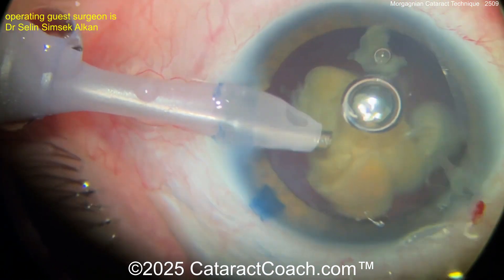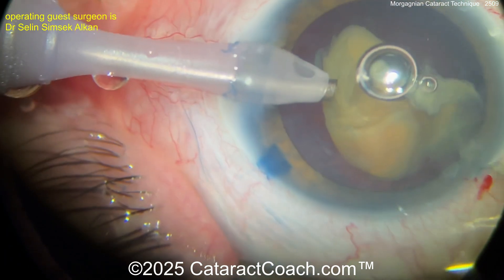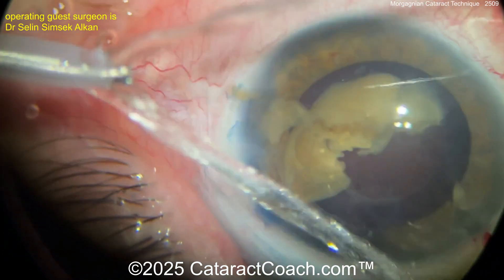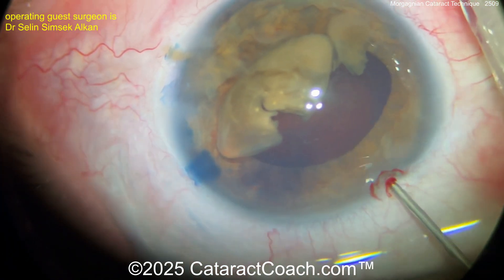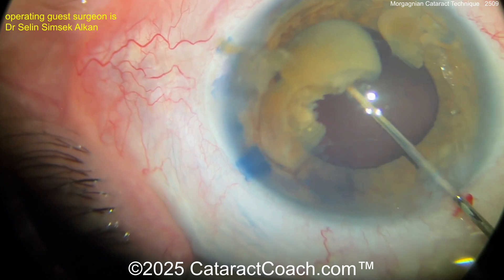Can you imagine how happy the patient is going to be? Going from hand motion or light perception — or if you move your hand fast enough, wind perception, right? Think about it. Anyway, some of you will get my joke, some of you will think I'm crazy. But finishing up the case here.